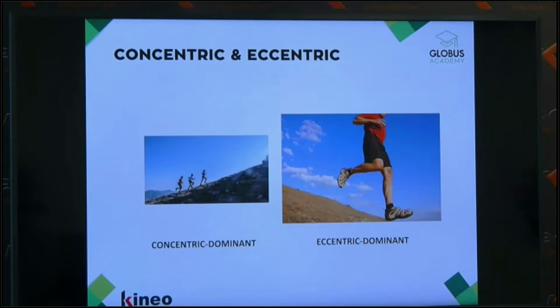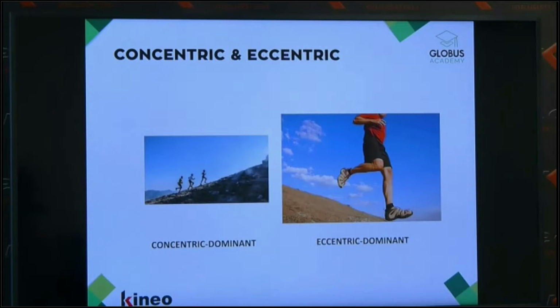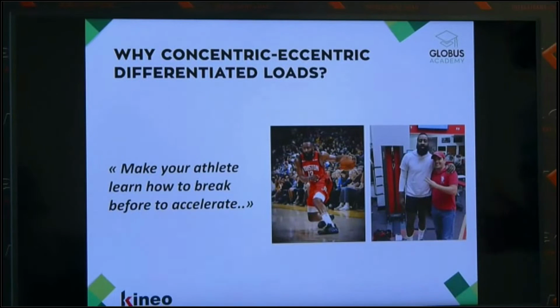Those activities are definitely something that you can experience every day, and maybe you know it, maybe you don't, but we understand that there are also mixed compositions, like we are not only using concentric and not only using eccentric. And so, on the importance of eccentric training, the next question we must ask ourselves is, why should we have concentric eccentric differentiated loads?